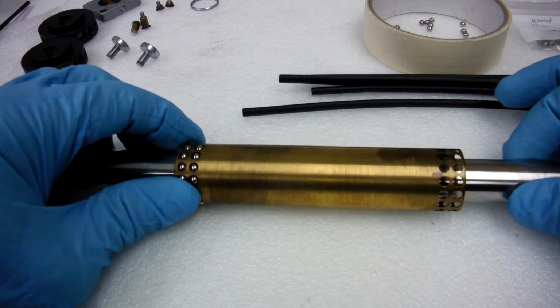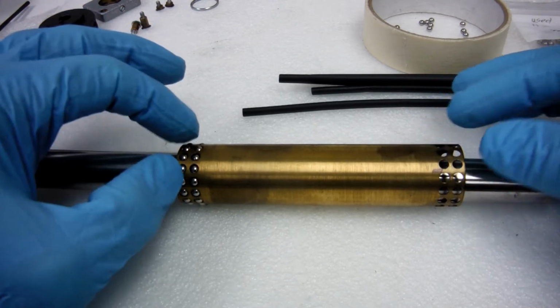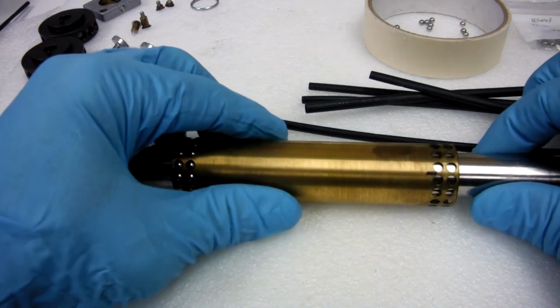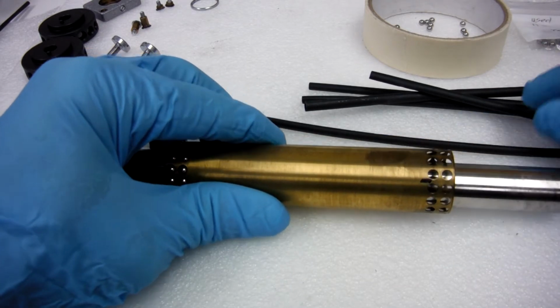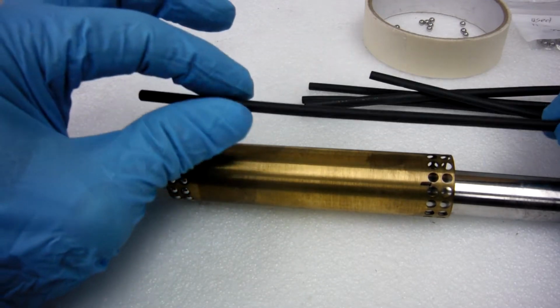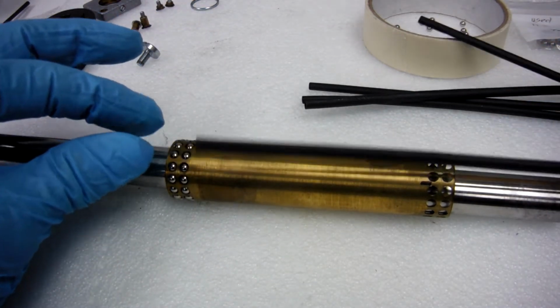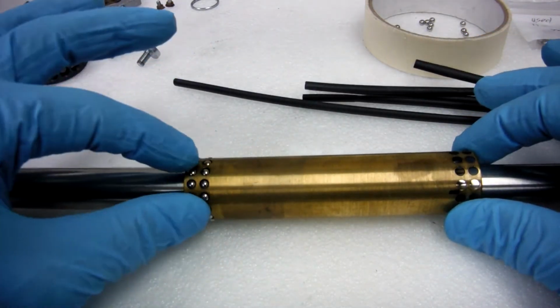They're 4mm. There's 60 bearings all total, 30 on each side. And what we're going to do is put something in here to help you keep it round while you're putting bearings in. And one thing you could use is heat shrink. It's flexible. This is an 1/8 inch size. And if you get it long enough, you can go through both sides in case your bearings are out on both sides.